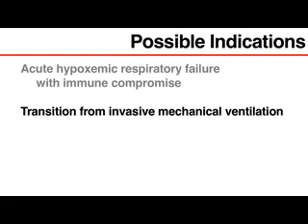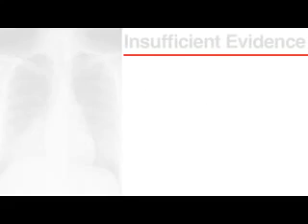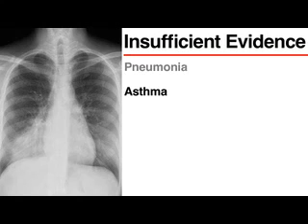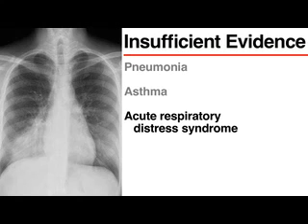An experienced practitioner should determine appropriateness on a case-by-case basis. There is insufficient evidence to recommend BPAP for the treatment of pneumonia, asthma, and the acute respiratory distress syndrome.